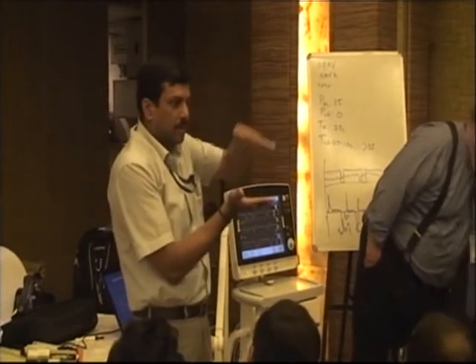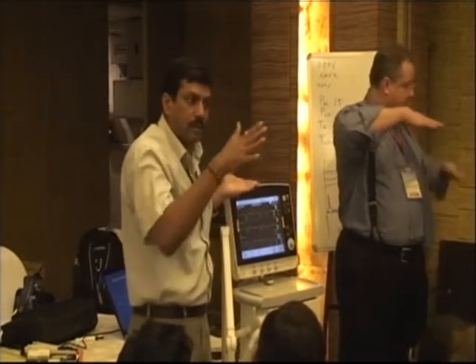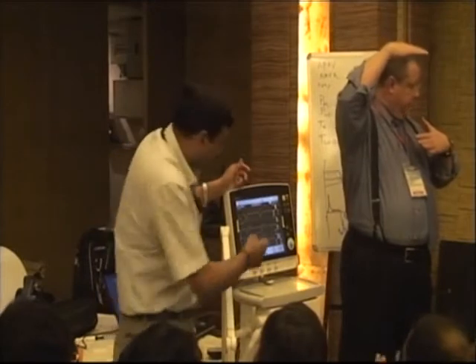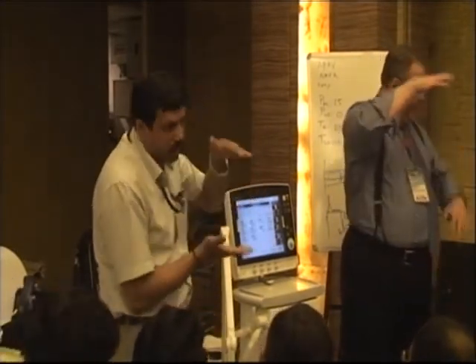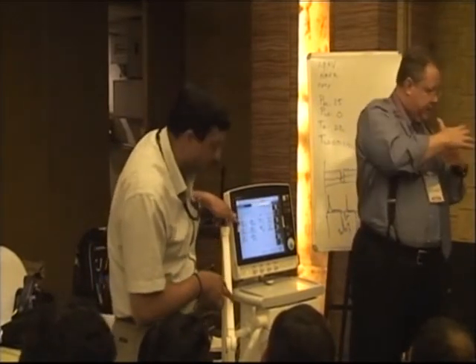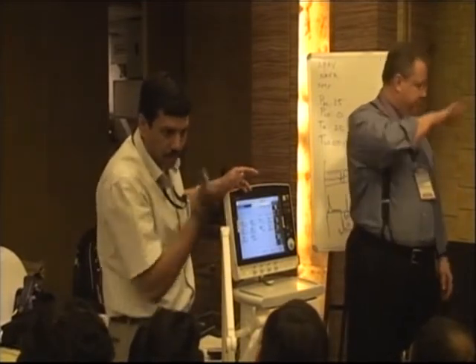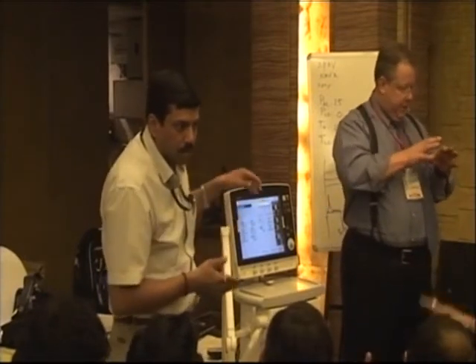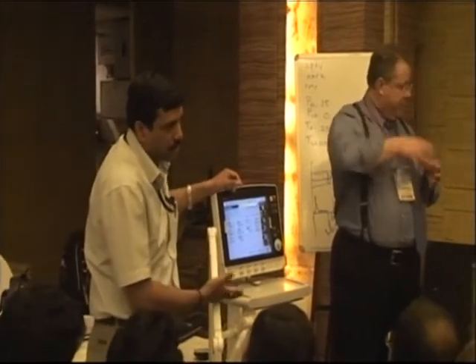Probably not necessarily, because you're not getting as much strength. The patient can breathe more spontaneously than on the oscillator, and you maintain the airway pressure, but you're not having that large delta. You're really depending on the opening pressure and the closing pressure, so the high pressure, P high, and the low pressure. That depends on the patient, sir: at what pressure the alveoli are collapsing, and at what pressure the alveoli are opening. When they're breathing, you have to think that they're doing a little bit more opening and closing on their own.